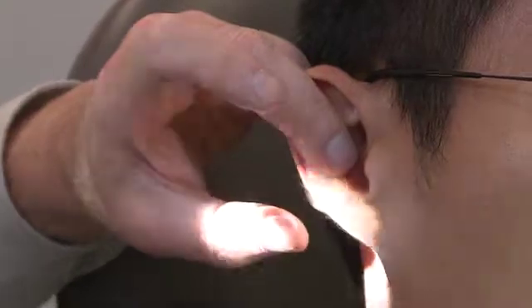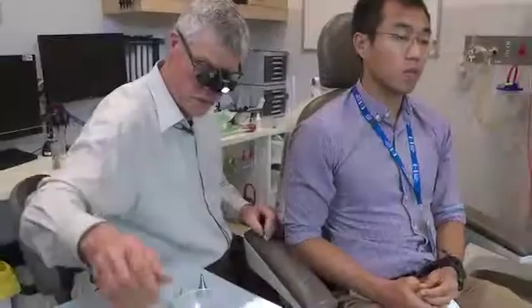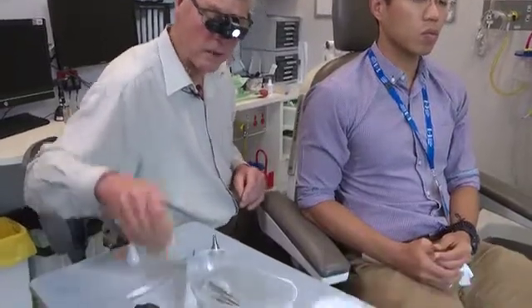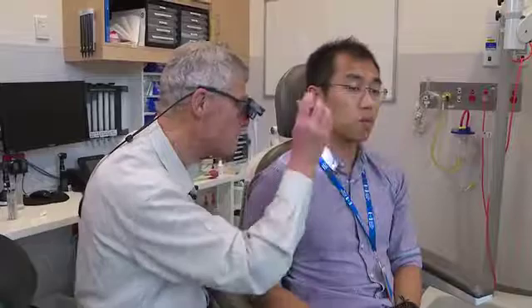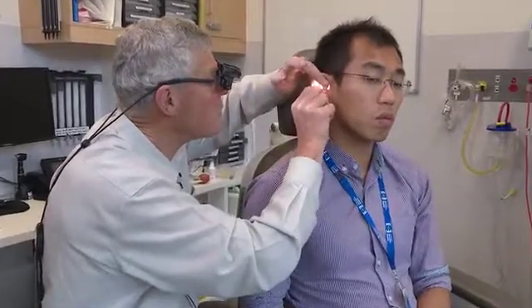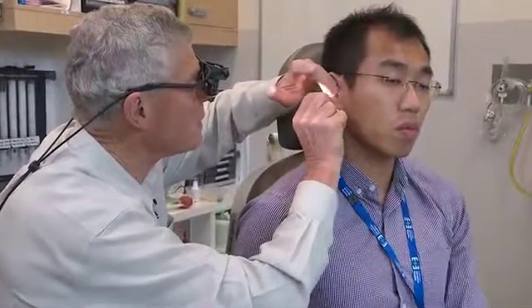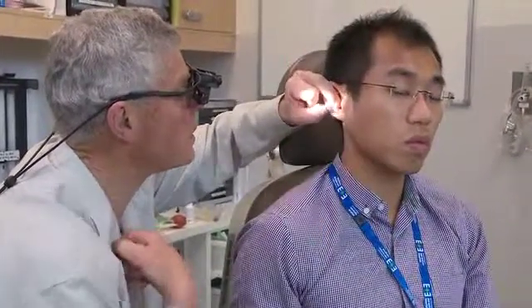So if you can see what you're doing, it's a relatively easy procedure and you'll have a success rate far higher than you will with any other instrument. It's exactly the same in a nose, except you'd use a bigger hook. We'll just go through it from beginning to end. I'll be saying: I'm going to look in your ear, it will be like this, feels like this. Then the other thing you have to learn is if you're going to hold an instrument with this hand, you have to be able to pull the ear out and hold the speculum with the other hand.